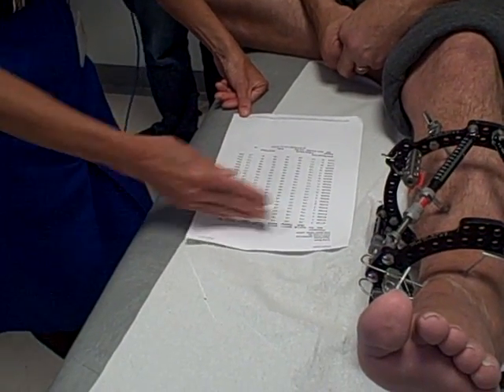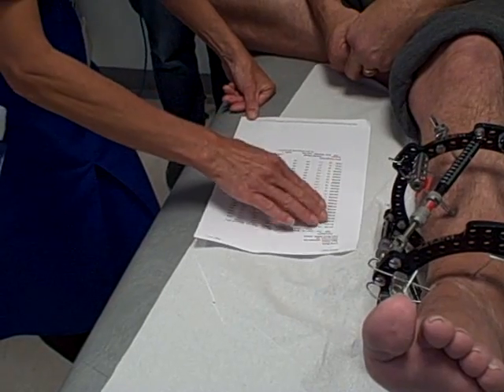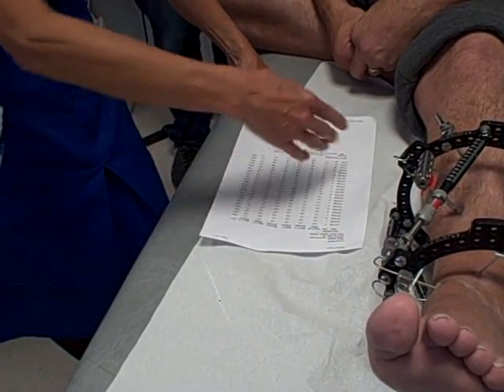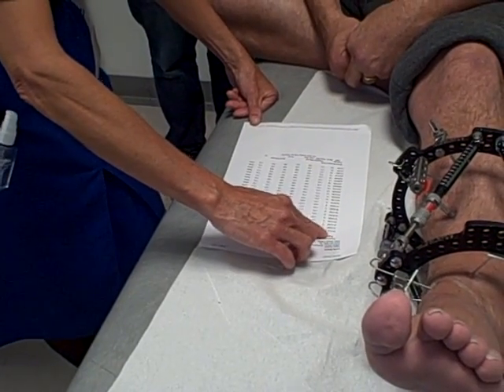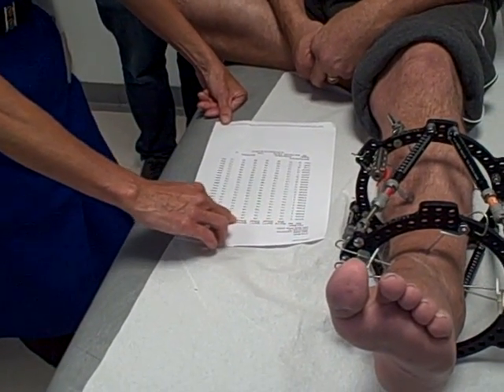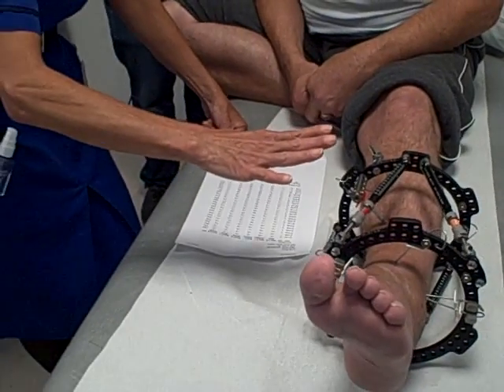Down here we have the dates, so you've got the strut numbers at the top, the colors, and the dates. It's American software so they put the month first, unlike us — we put it second. So the eleventh of the sixth is written as six-eleven the American way, and all these numbers should be preset.